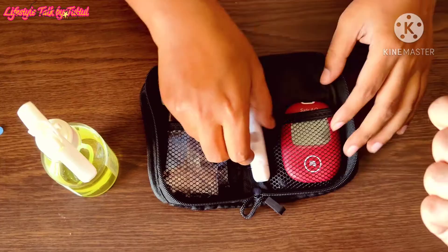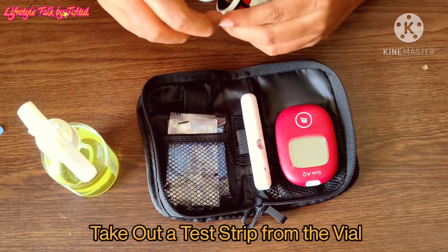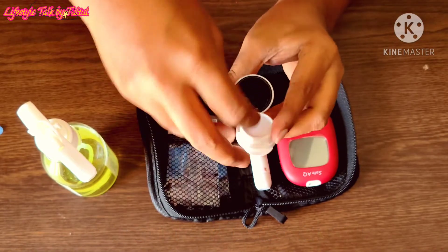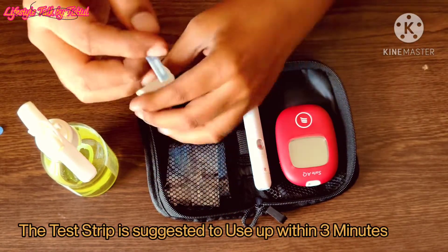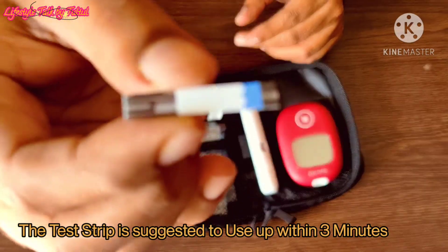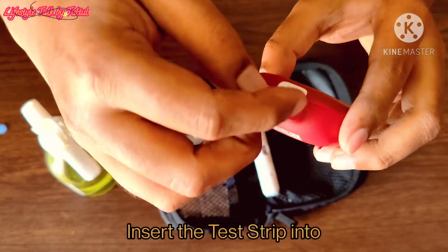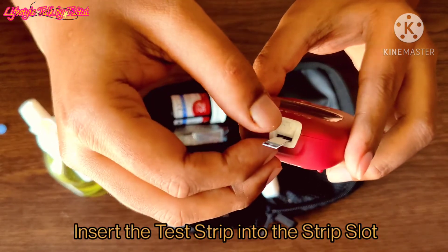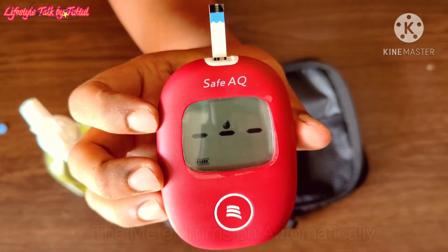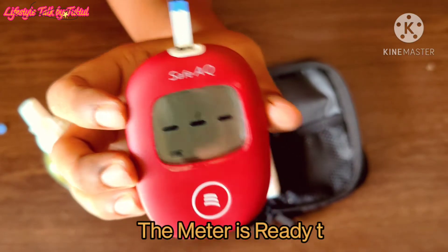The lancing device is now ready to use. Take out a test strip from the vial. The test strip is suggested to be used within 3 minutes. Insert the test strip into the strip slot. The meter turns on automatically. When the blood symbol starts blinking, the meter is ready to use.